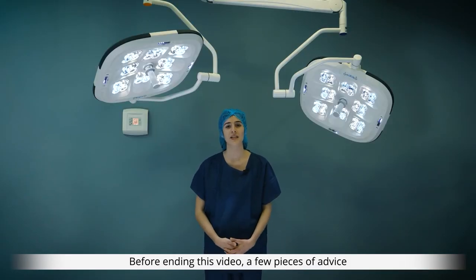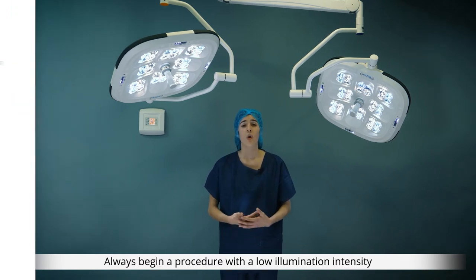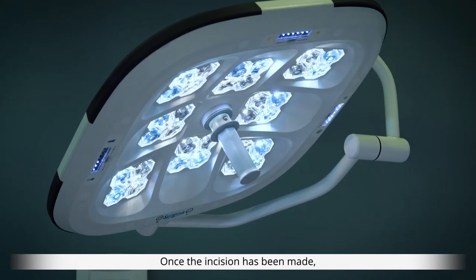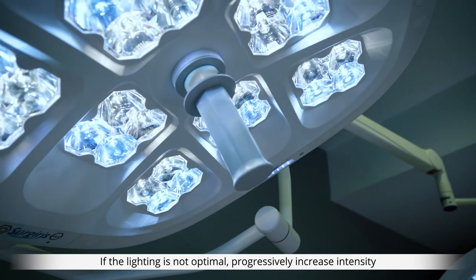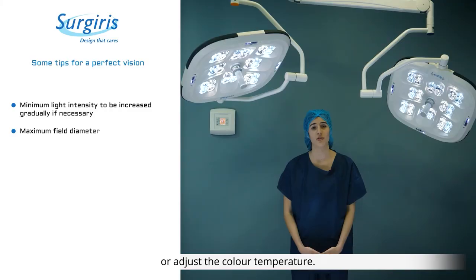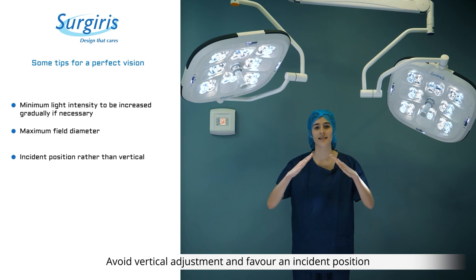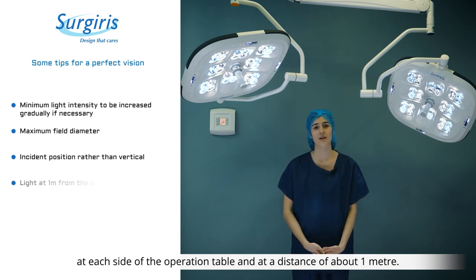Before ending this video, a few pieces of advice for optimal vision during procedures. Always begin with a low illumination intensity and a large spot diameter. Once the incision has been made, you may increase illumination intensity one level. If the lighting is not optimal, progressively increase intensity or adjust the color temperature. Also ensure your lights are positioned correctly — avoid vertical adjustment and favour an incident position at each side of the operating table at a distance of about one meter.